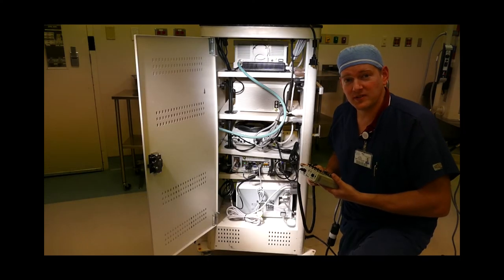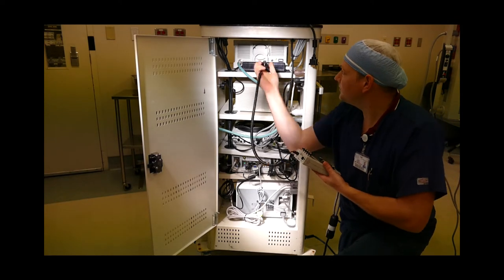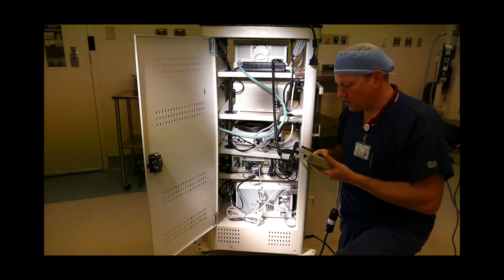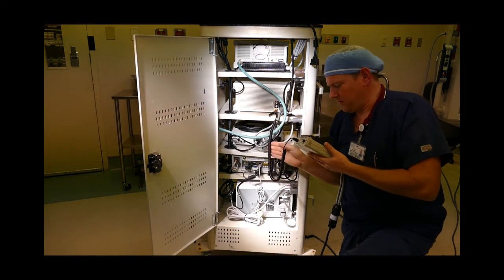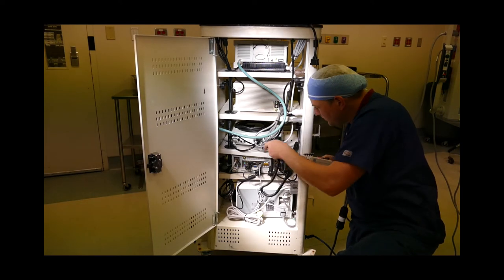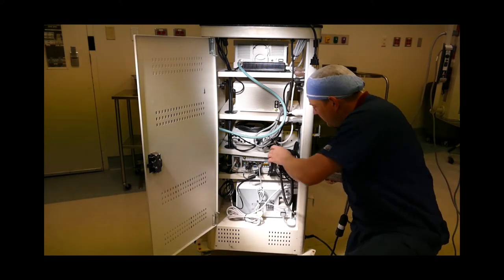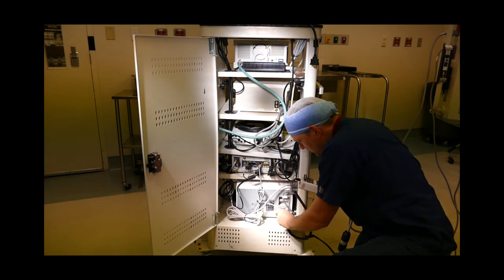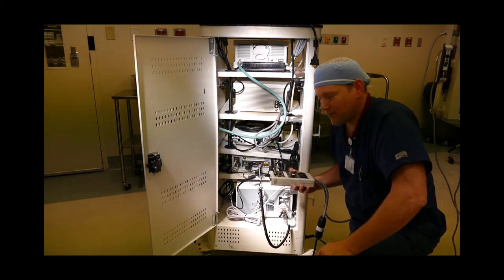Now the earth resistance test for all the components inside the cabinet. Starting at the top: connect to the ground lug — 0.17. Next component: 0.23. Then 0.23, 0.23, and 0.26. So all of these components test out on the ground.